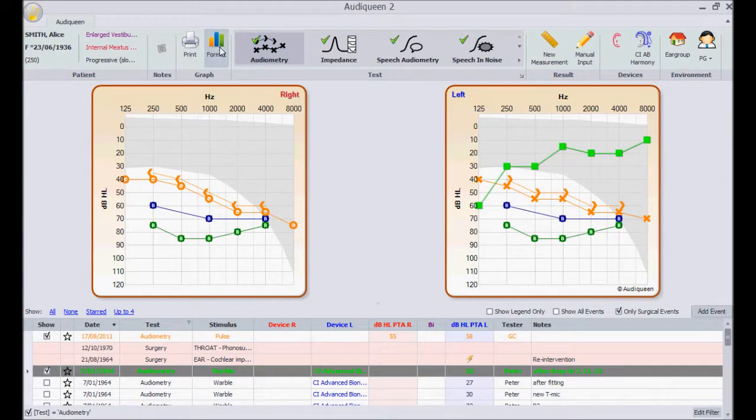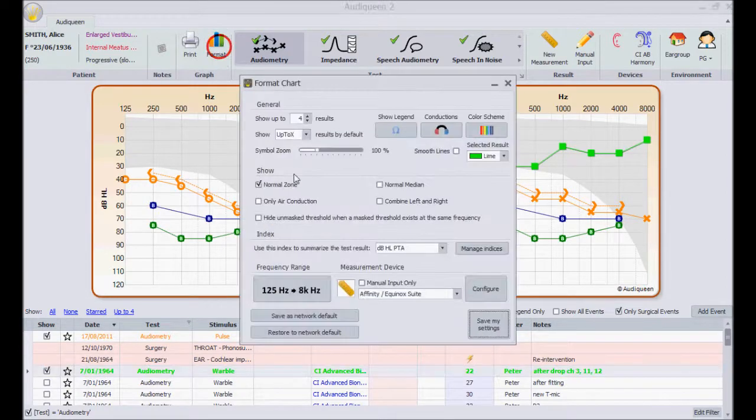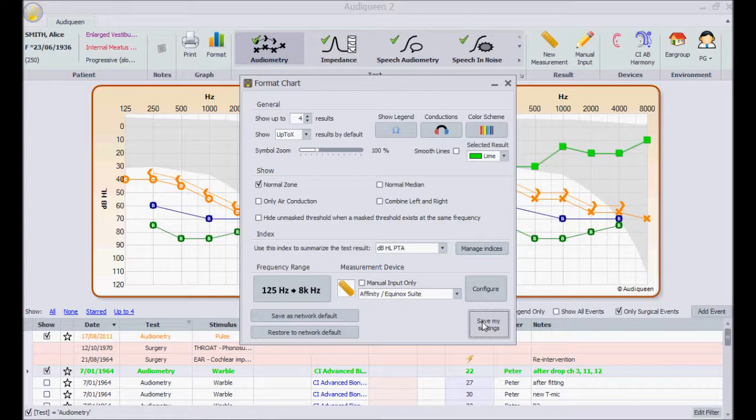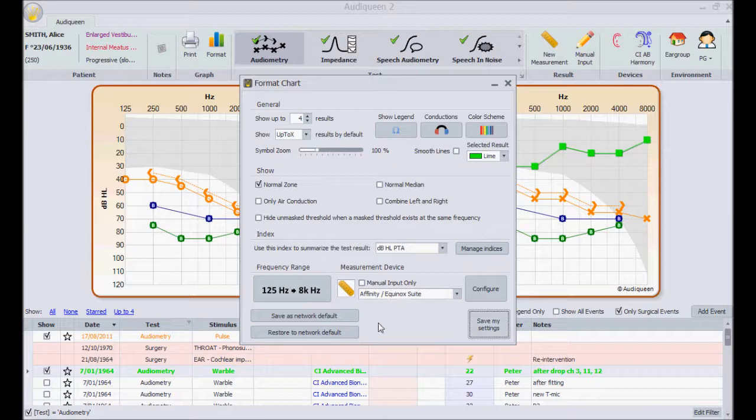I can save these settings here. This is under my personal account. It will have no impact on how my colleagues get test results displayed on their own screen.